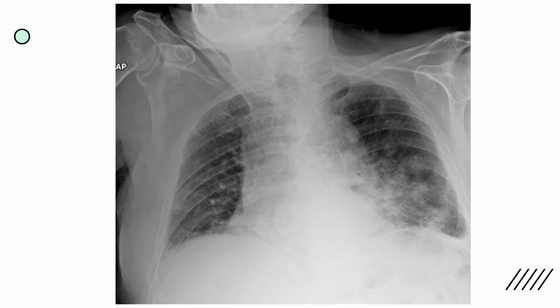This is a not so good image of the chest. So in this one, the patient's definitely rotated. We can tell because here's clavicle and here's also clavicle. So it's almost like they're shrugging their shoulder on one side. It could be that the patient was in a lot of discomfort. It does look like they do have some lung pathology here, maybe some pneumonia.